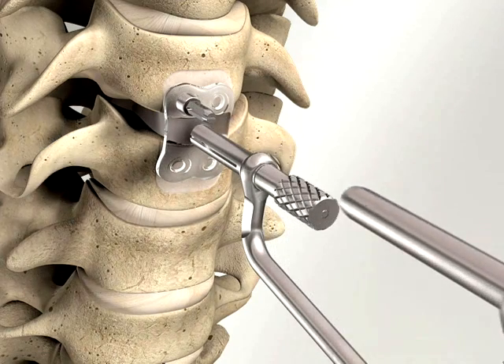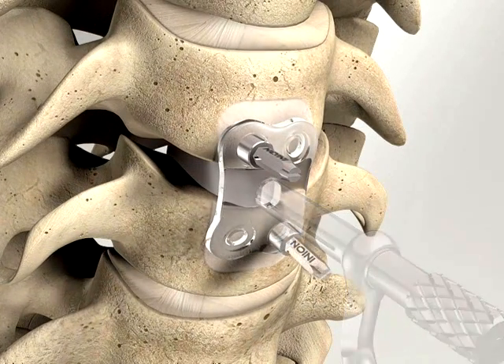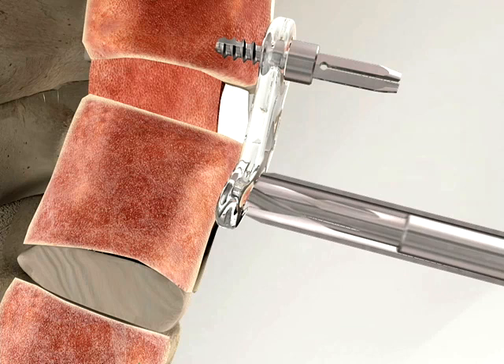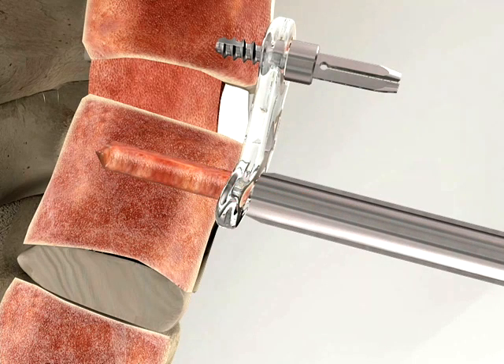It is recommended that two temporary fixation screws are inserted to avoid plate movement. The temporary fixation screw immobilises the plate for secure placement of the system screws. The final screw hole is drilled using the correct size drill bit attached to a slow speed drill, at no more than 2000 revolutions per minute. The drill guide should be kept at its exact angle for subsequent tapping.